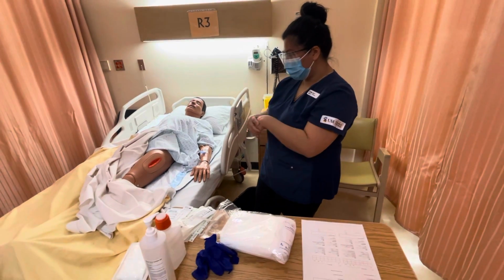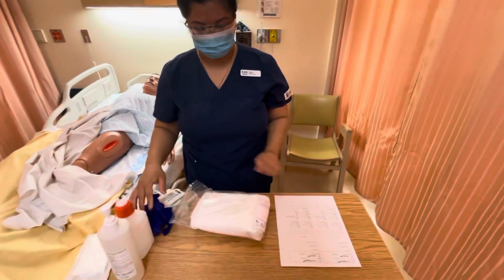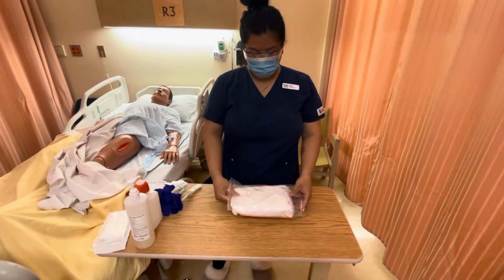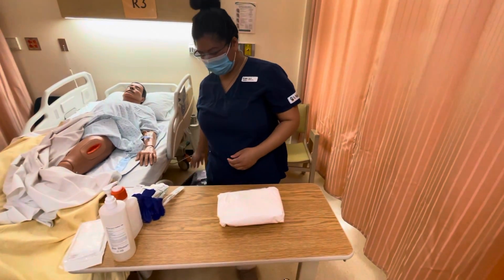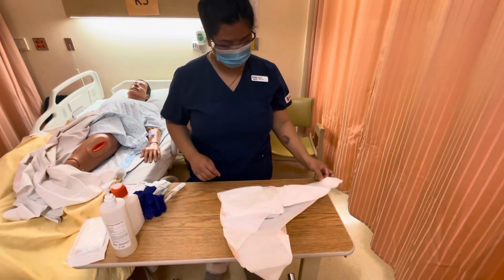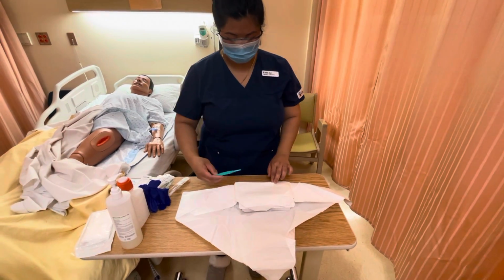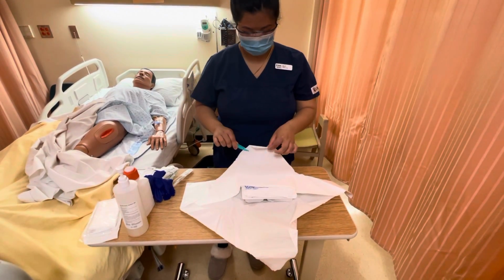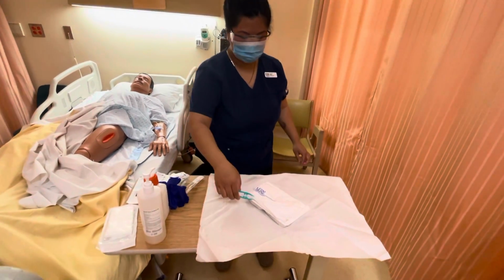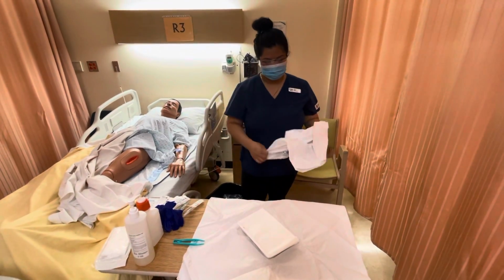Okay, so Ms. Maragamo, I'm just going to set up my sterile dressing tray. We're going to open up our sterile dressing tray, making sure we're only touching the 1-inch border. And we have our forceps underneath. And then we have our garbage bag. So I'll just pass that on to myself and set it up on our patient's bedside.